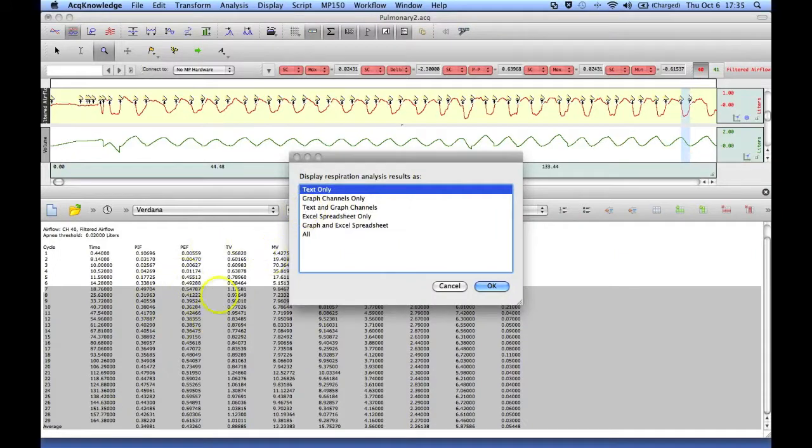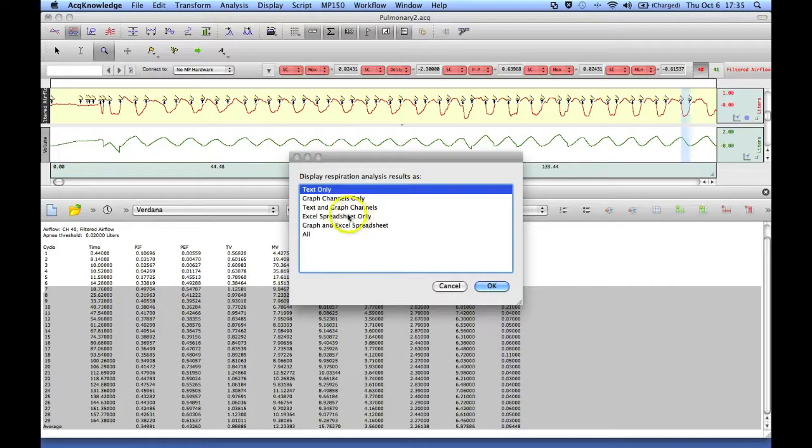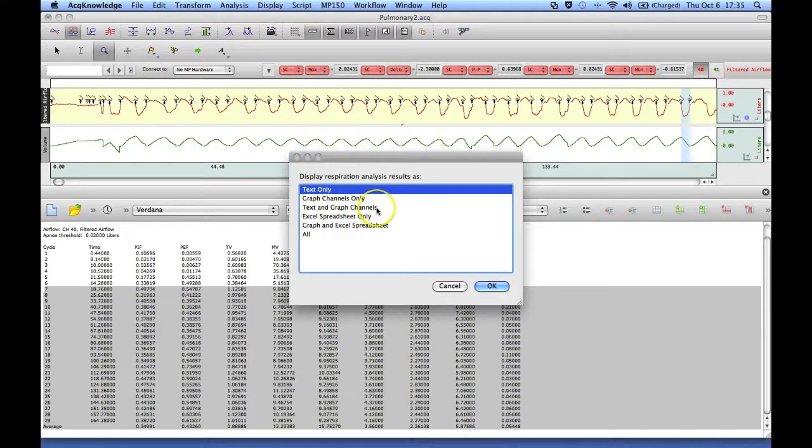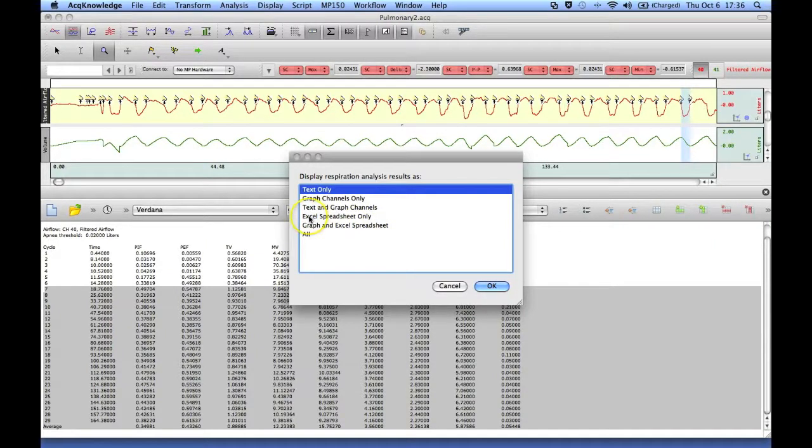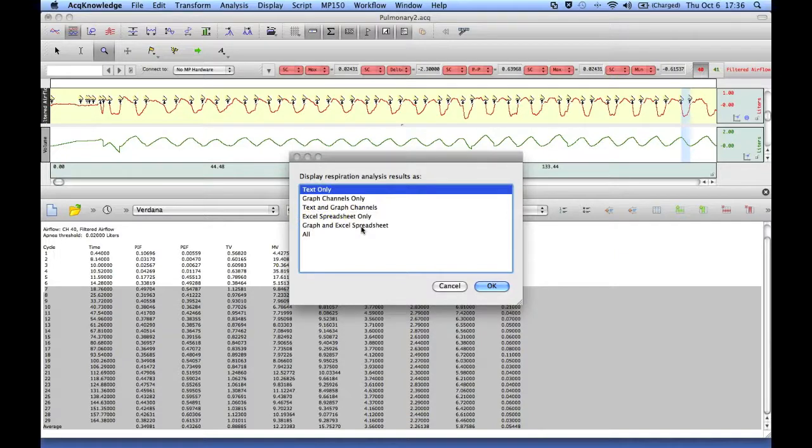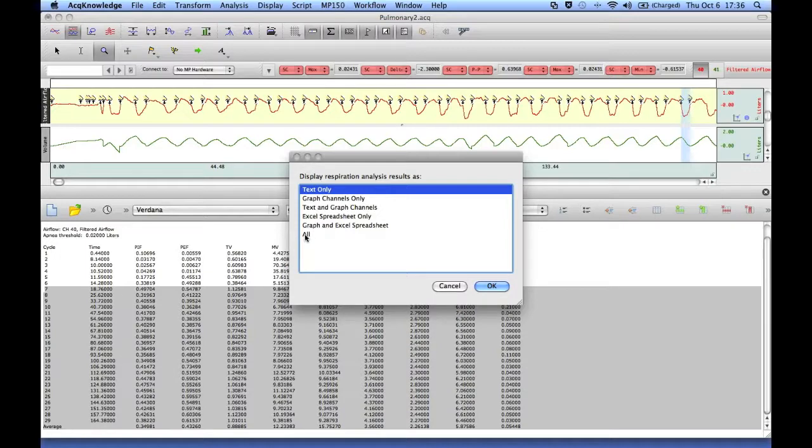We can actually graph each of these measurements as new channels, and we can do both. So the measured values are pasted down into our journal file, and they're displayed as new graph channels. And similarly, we can paste the measurements into Excel, and graph them, and display them in Excel at the same time. Or you can do all, which will give you journal, Excel, and the new channels.